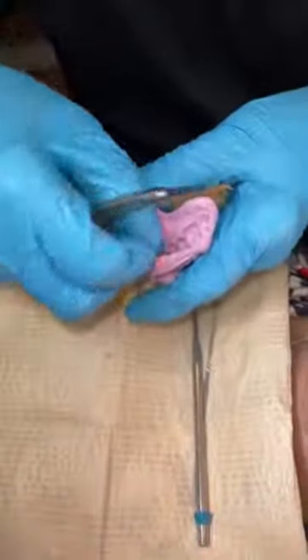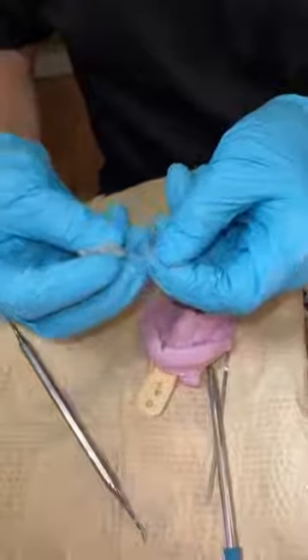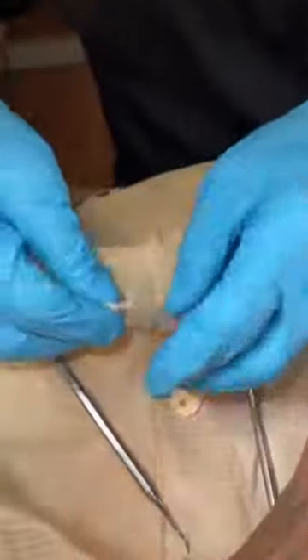In this picture, we're also making Nicole some temporary veneers or temporary crowns to wear while she is waiting on the permanent restorations coming from the lab. So in this photo, I'm trimming, polishing, smoothing her little temporaries to make them look like natural teeth. And so now we're cementing those in place. So she walked in looking all snaggletooth, and poor thing was jagged and her teeth were sensitive. And then we got through and she's fine.